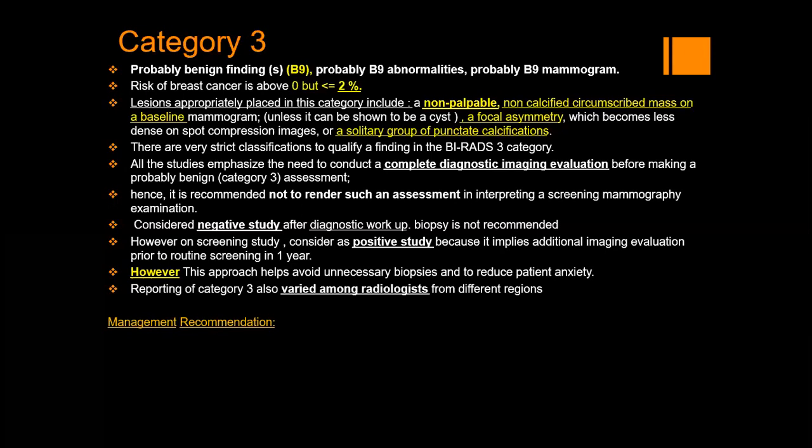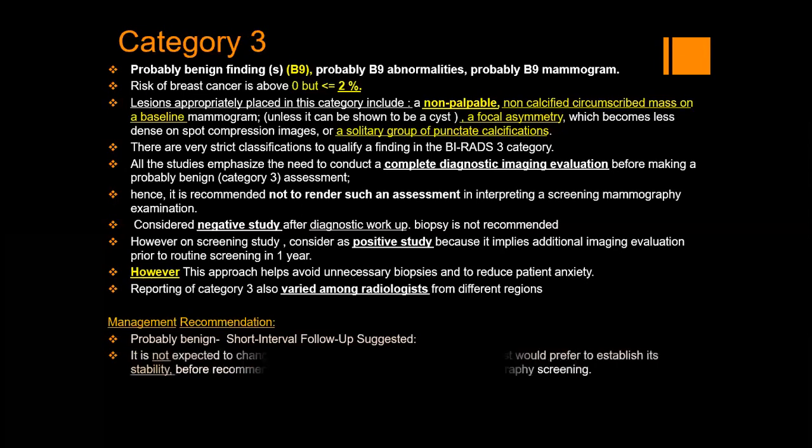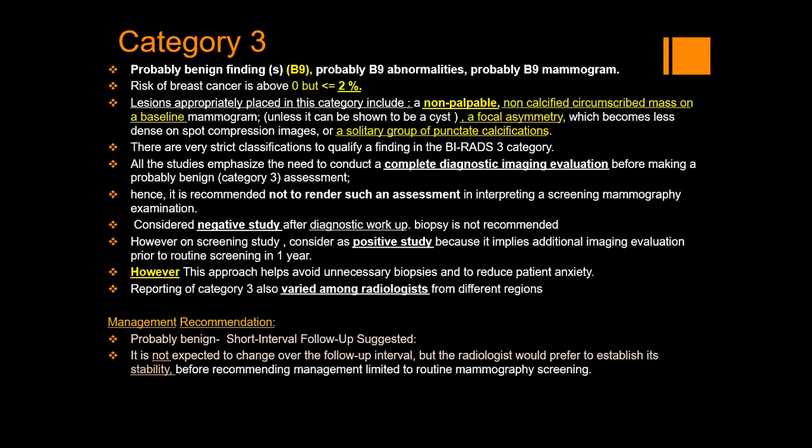What are the management recommendations? As described, a short-term follow-up at 6 months after the baseline mammography, then another 6 months, then 1 year, then 1 year. It is not expected to change, but the radiologist prefers to establish stability before recommending routine screening mammography.